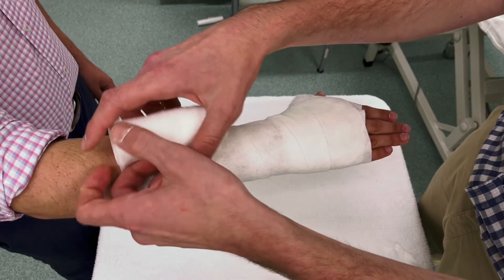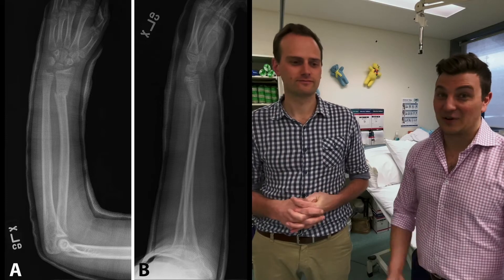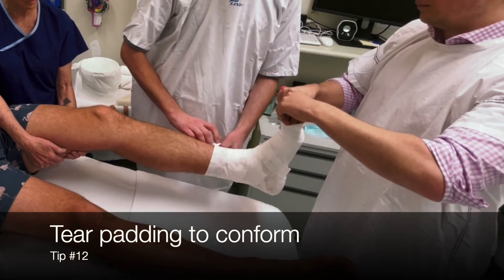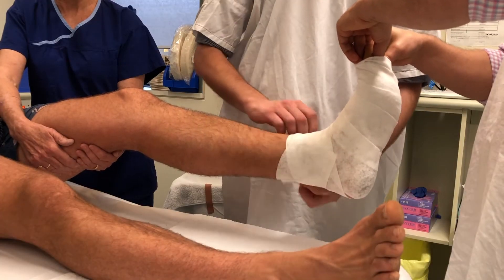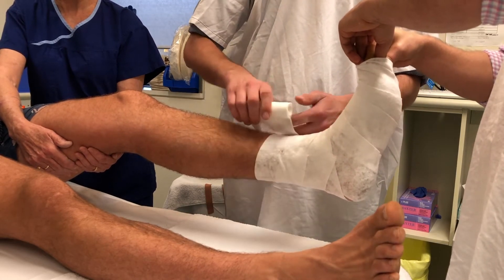More padding is fine for a resting slab going to theater or an undisplaced fracture, but if you're doing a reduction you want to hold the position firmly — too much padding just leaves room for the fracture to displace. You can also see on X-ray if there's too much padding, which may be reason to change the cast. While applying padding, avoid bunch-ups, which are easy to get on conical-shaped limbs like a muscly forearm or a large calf tapering to a narrow ankle. Gentle tearing of the Webril helps it conform and avoids little ridges underneath.